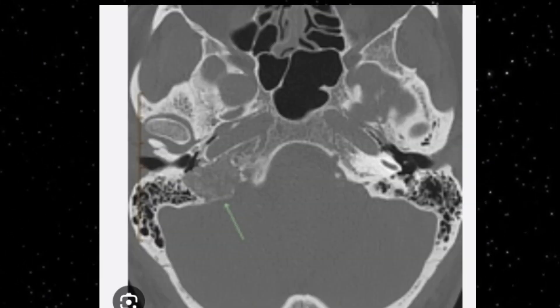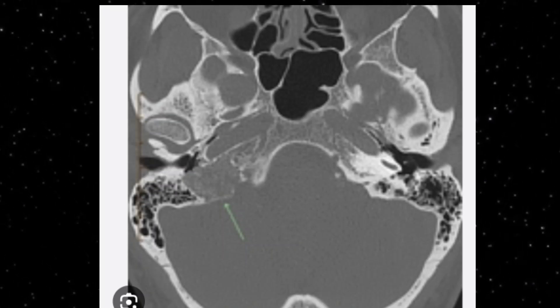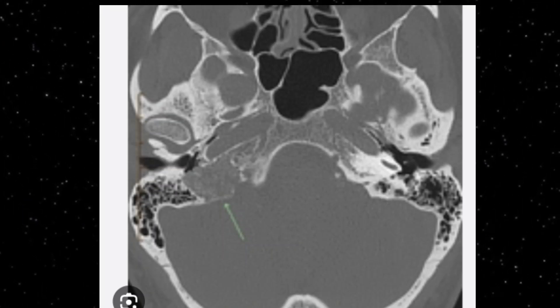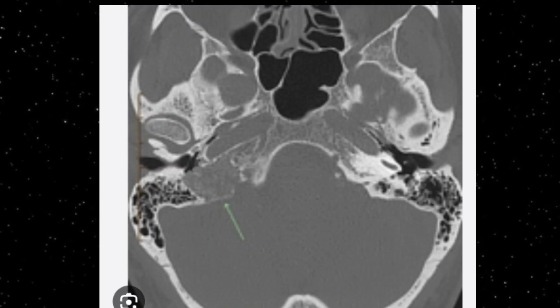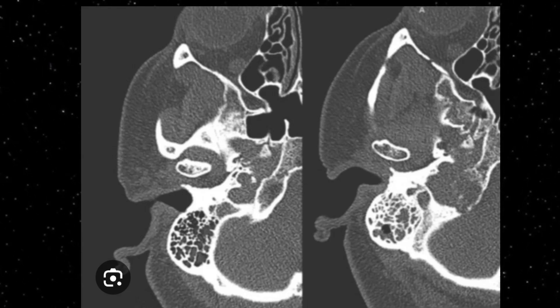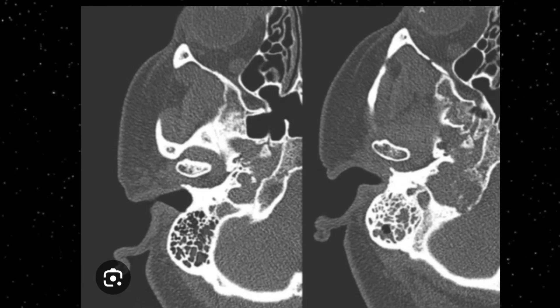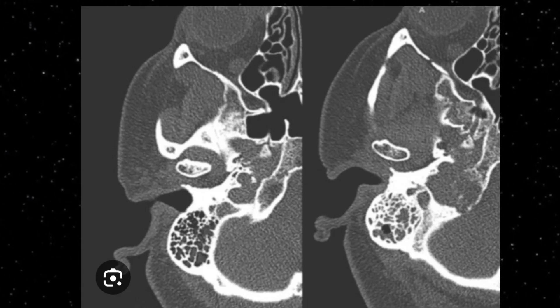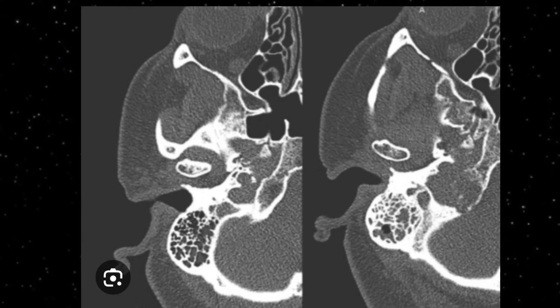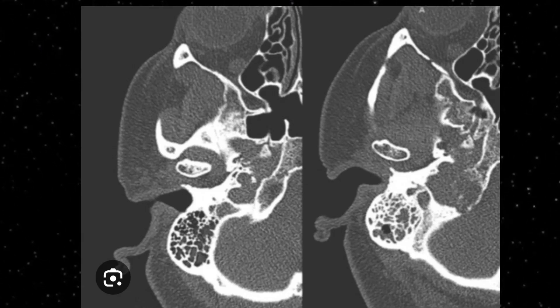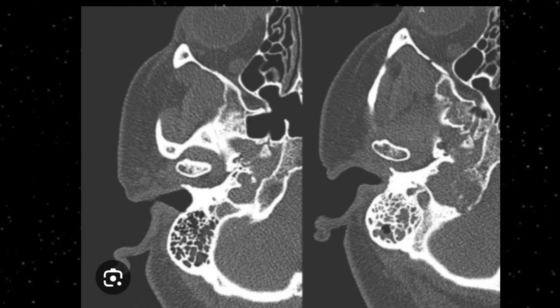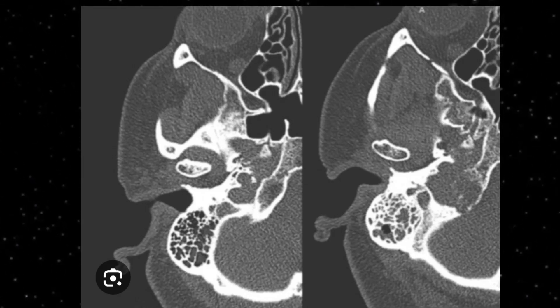A non-contrast axial CT image shows the right-sided enlarged jugular foramen having a soft tissue mass within it — this is the glomus jugulare tumor. Two images are shown for comparison: the image on the left shows an enlarged jugular foramen, while on the right it appears normal. On the abnormal image, there is enlargement of the jugular foramen and moth-eaten destruction of the surrounding bone.